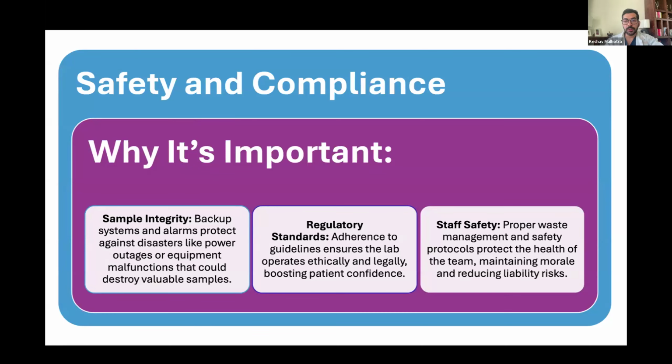Then we want to think about safety and compliance. Why is this important? Because let's say in certain scenarios of flooding or fire, we would want a good escape plan for our cryopreserved embryos and for our stored embryos and samples from within the laboratory to outside. And if this is not incorporated right from the get-go, it's very difficult to implement later on, and these will influence how you get compliances, especially in the Indian scenario, how you would get an NABH compliance for your laboratory if you don't have an exit plan and an exit route predetermined.